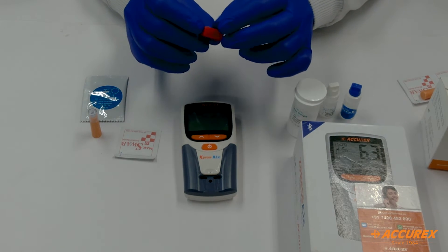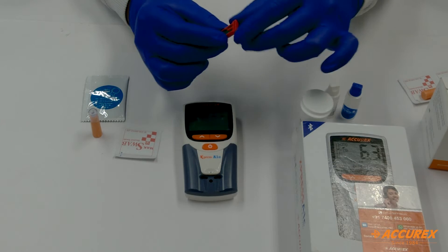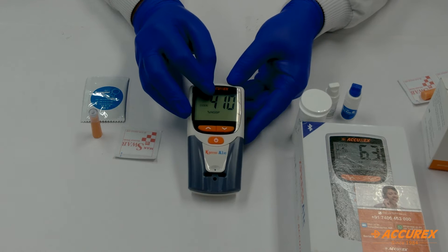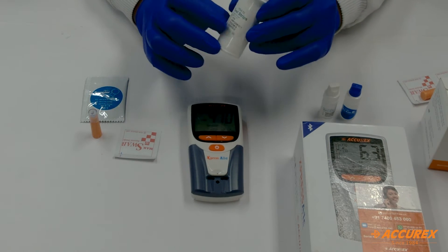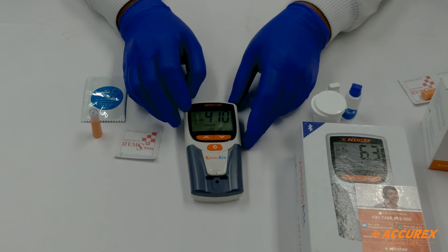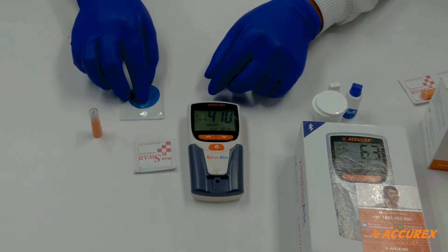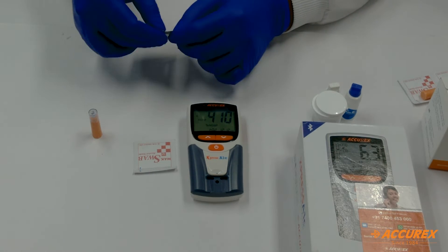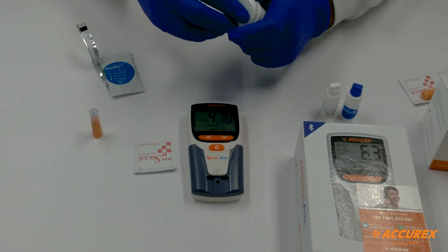Make sure the lot number mentioned on the strip and the strip bottle are the same. Once the strip is inserted, it will show the same number mentioned on the code chip, and this number should match with the test bottle. The machine will then ask you to please insert the test strips. Make sure the patient sample is ready at the time of testing. Here we have one candidate for testing. We will insert the test strip.